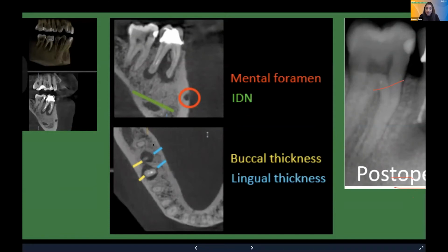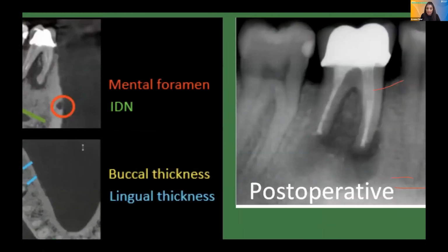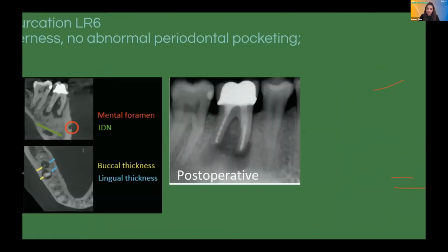And I can also see I've got a thick lingual plate. So if I'm going to be curettaging this lesion, I'm not worried about going in and disturbing the lingual artery because we've got a good thickness of the lingual plate. This is straight after the root canal surgery, and I saw this patient actually last week for a 3-month review, and the lesion's healing beautifully, which is great.